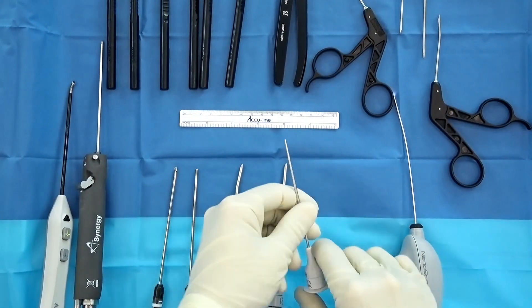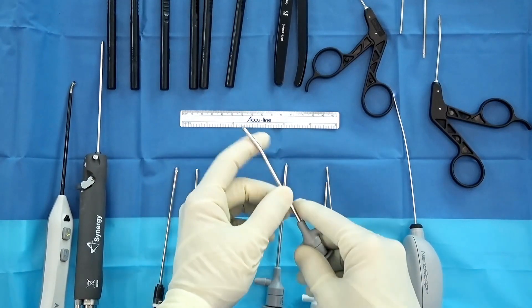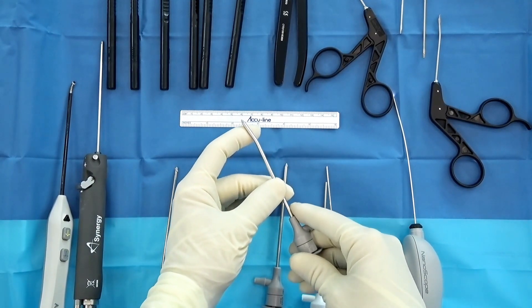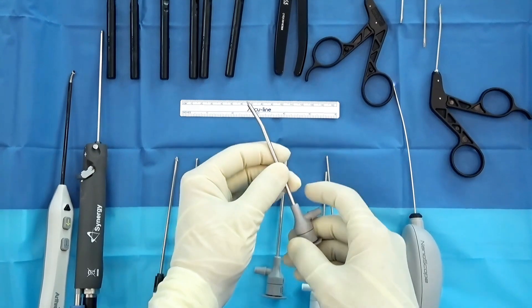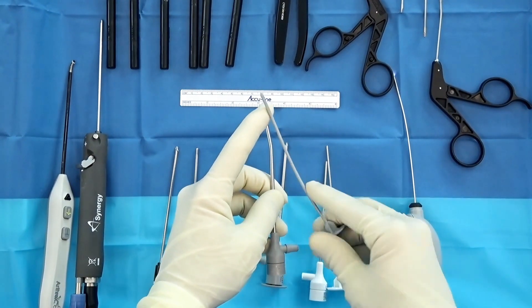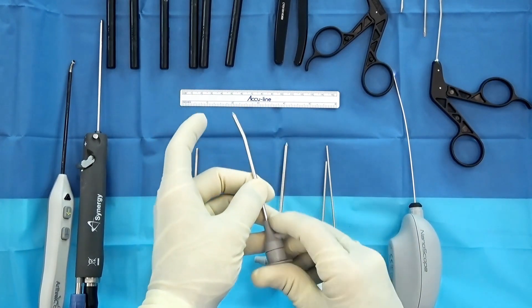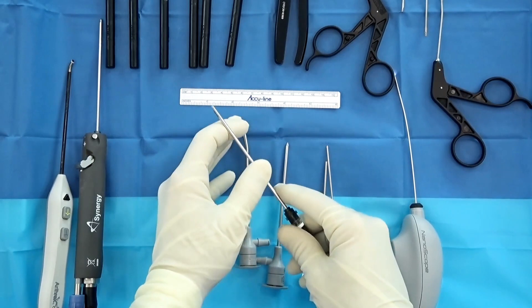Your kit comes with a white low-flow cannula that also has a sharp trocar inside it. What I prefer in my clinic and with my patients is using this 10-degree nano. I also teach residents, and this comes with a blunt tip that's nice and smooth and really helps protect the cartilage as I come in and out of the joint.